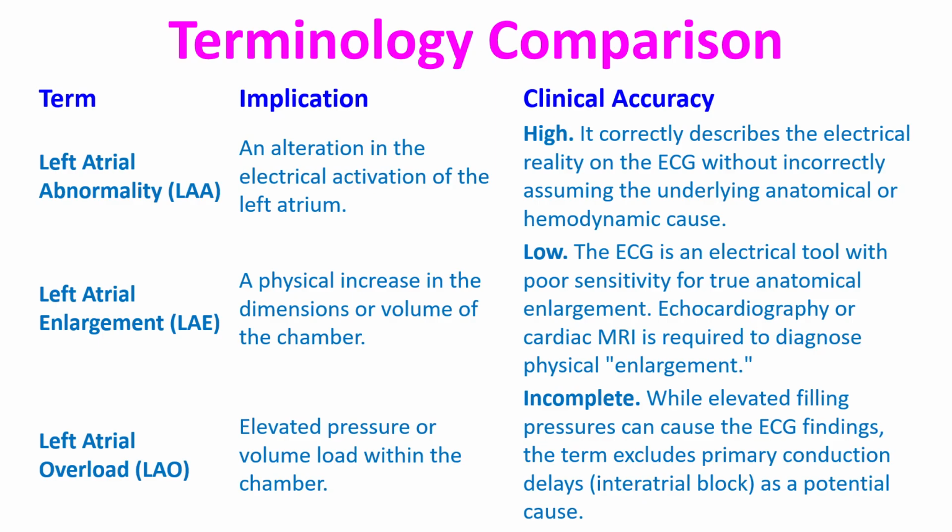The clinical accuracy is low. The ECG is an electrical tool with poor sensitivity for true anatomical enlargement. Echocardiography or cardiac MRI is required to diagnose physical enlargement.